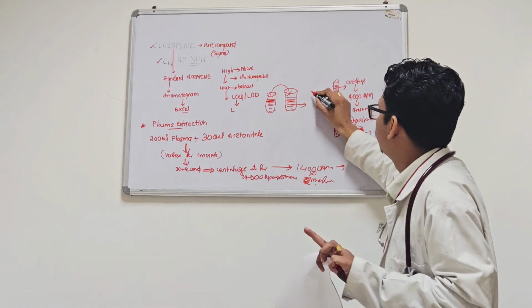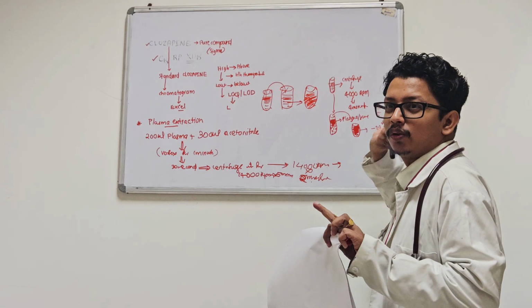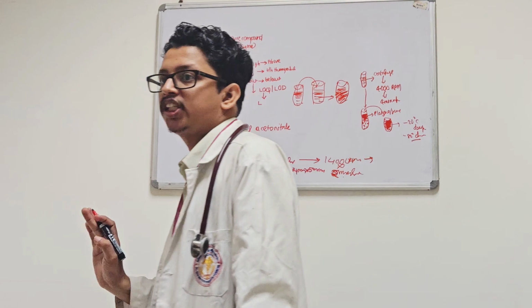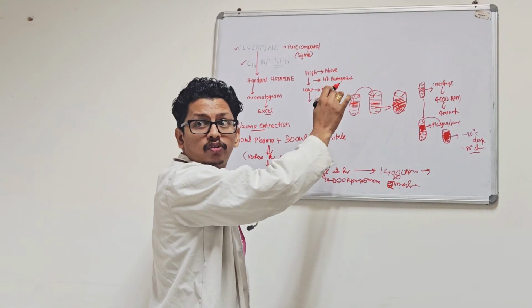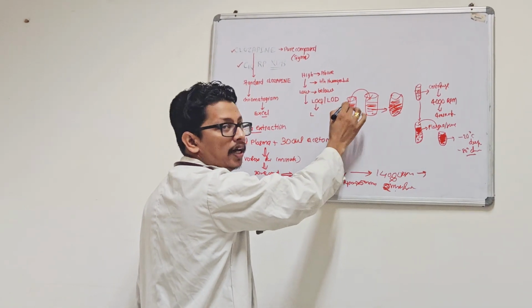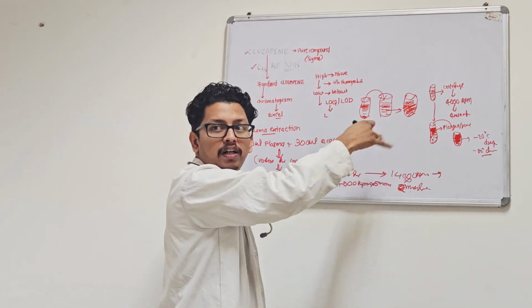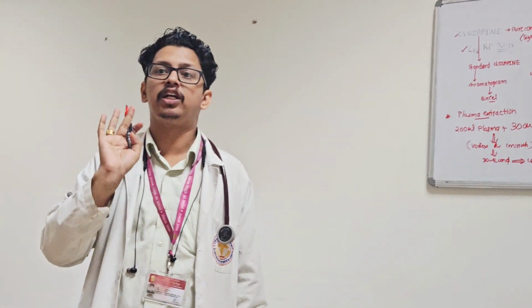उसके बाद we will get the very pure liquid only containing the drug dissolved. समझा है ना? So this entire process of extraction of the compound dissolved in the solvent is called a solid liquid extraction. Why it is called a solid liquid extraction? So we will convert the plasma into two interfaces. One is pelleted part, that is solid, another is solvent, pure solvent, that is liquid. Again we will transfer out the liquid, and again the pelleted part, again we will transfer out, then only this liquid which is dissolved in the drug. So it is called a solid liquid extraction.